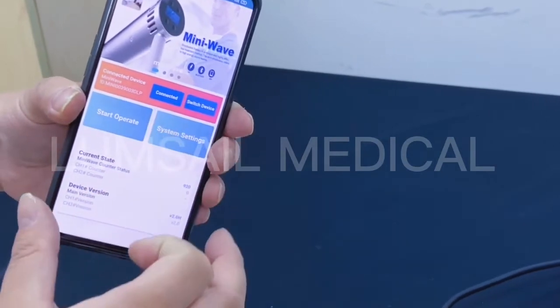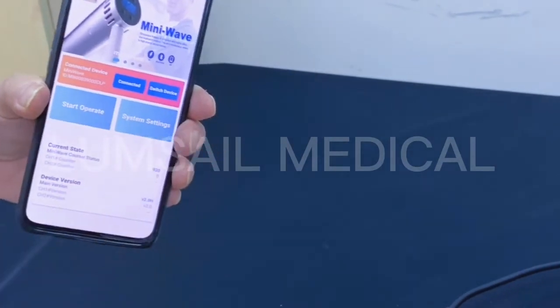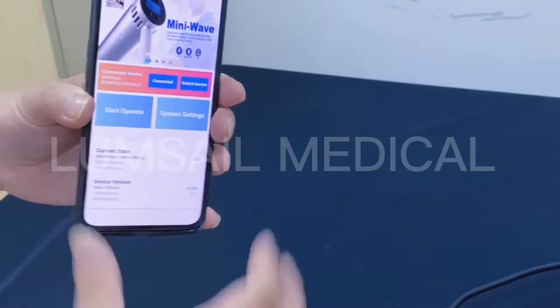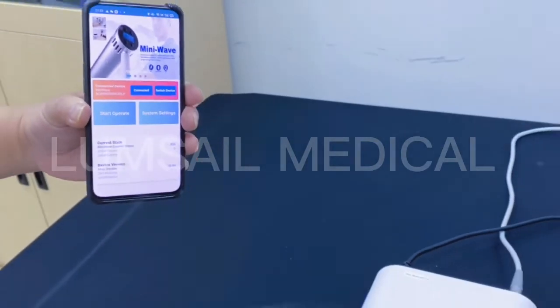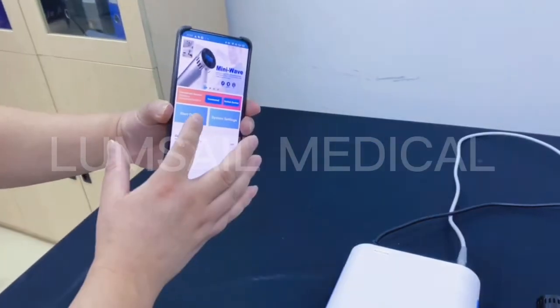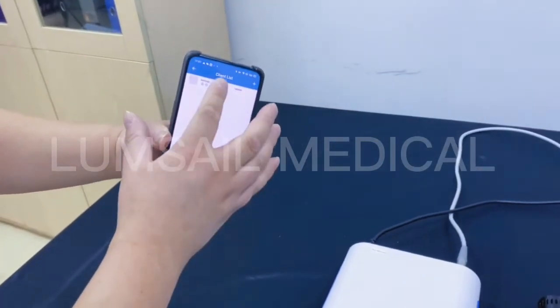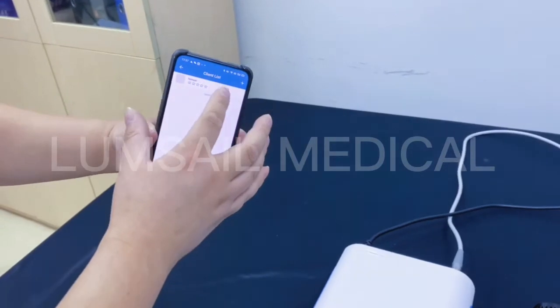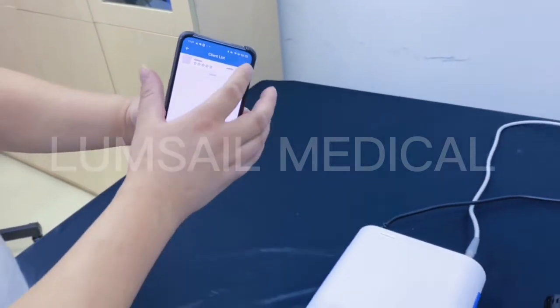You can also switch to other devices — with one cell phone you can manage several Mini-Wave units. Now we start the operation. Here is the client list; if you have multiple clients you can create more clients here.